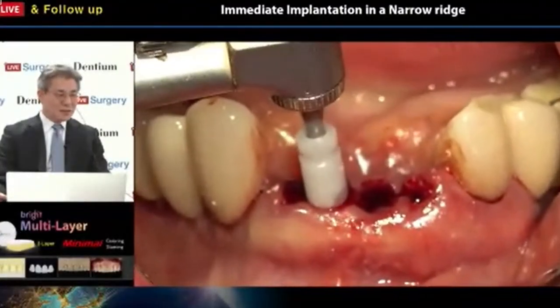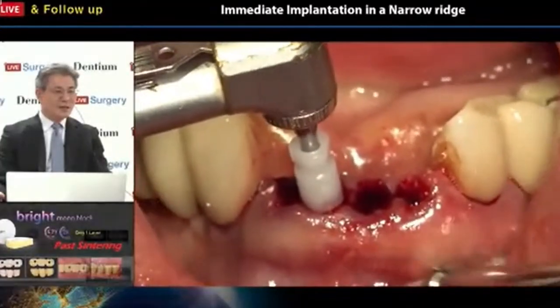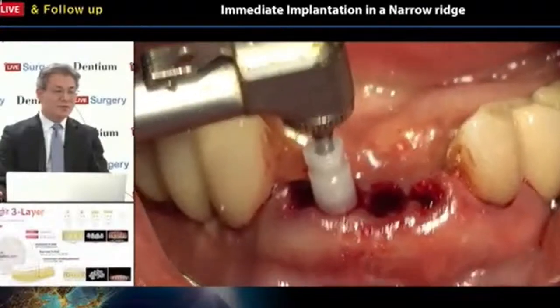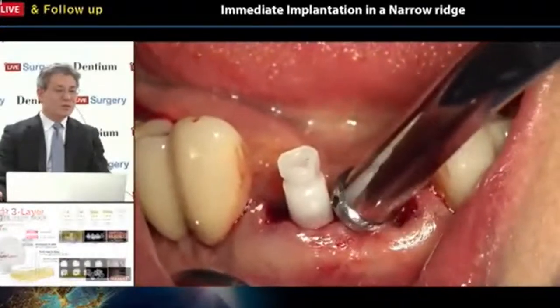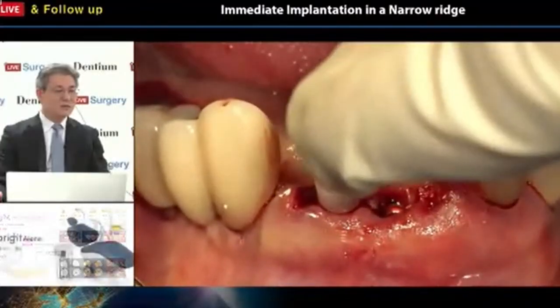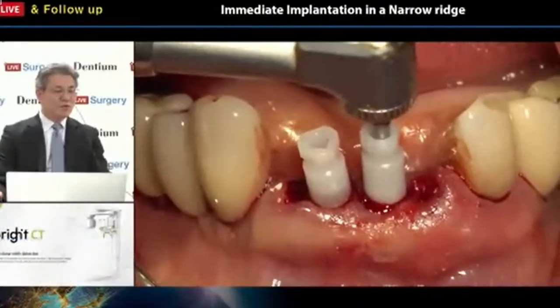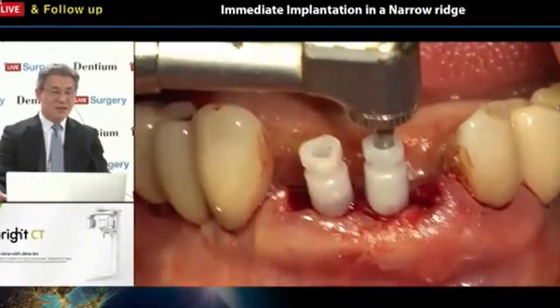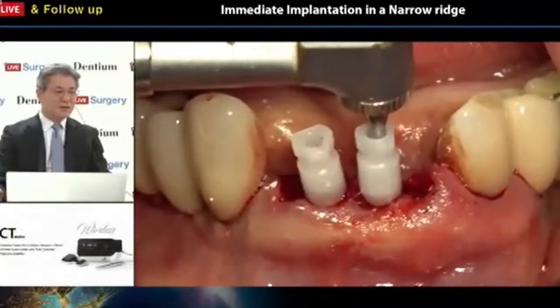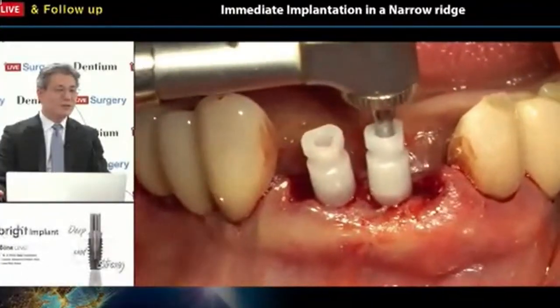This one is the scan abutment. The plastic is the scan abutment holder. The plastic cap promotes easy insertion and connection to the implant fixture top portion.